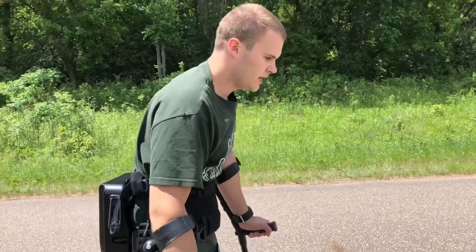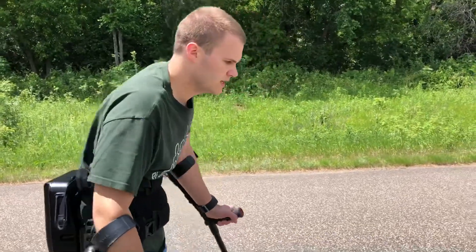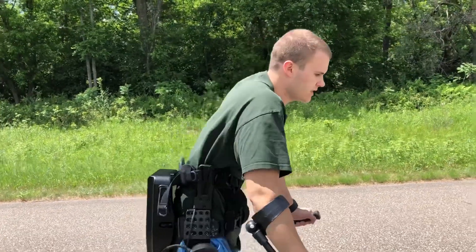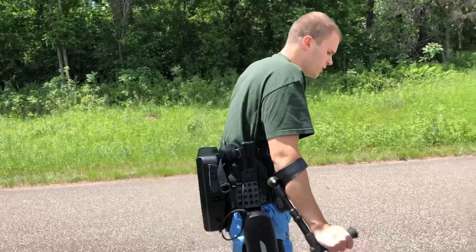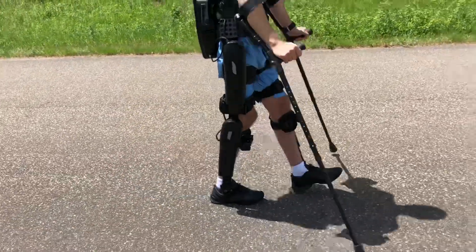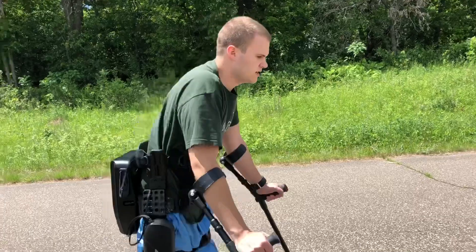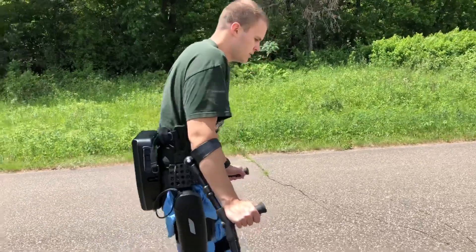Right now I can actually feel my left glute. I can feel the pressure, and it just feels really good to be able to feel that. I'm a spinal cord injury incomplete, so I have some sensation below my point of injury, and this is the first time I've been able to feel my glute like this. I'm really focusing on it the whole time I'm walking.